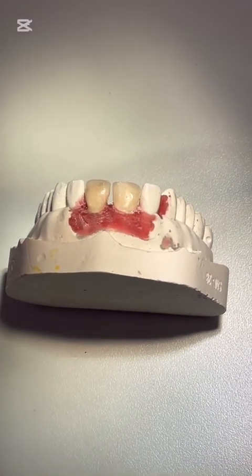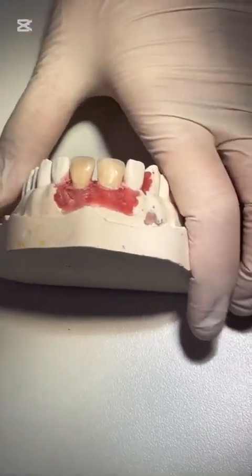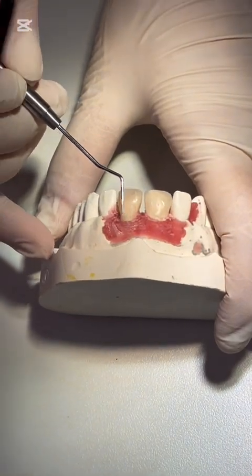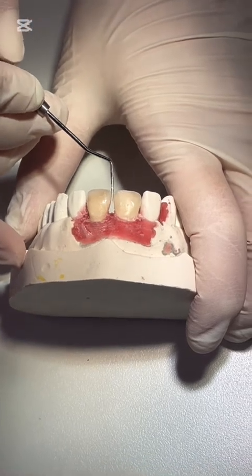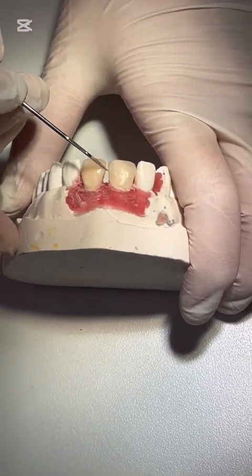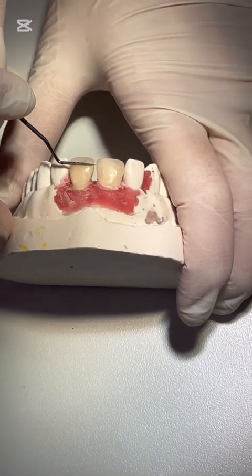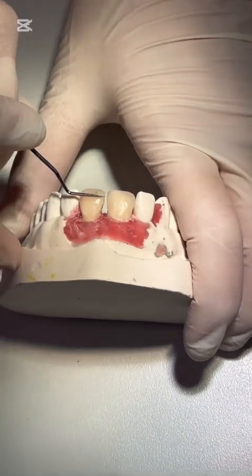In the cases of the diastema, we have several things to think about. First of all, I have to respect the golden ratio. Why? Because if I'm doing this treatment for aesthetic reasons, I don't want to end up with very wide central incisors, right? The patient will not be happy.